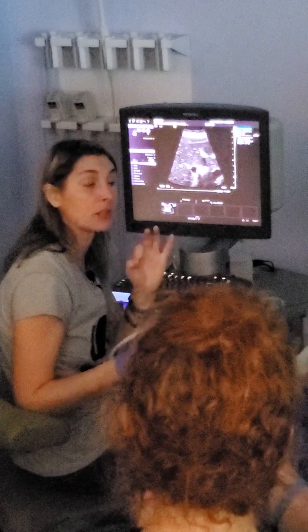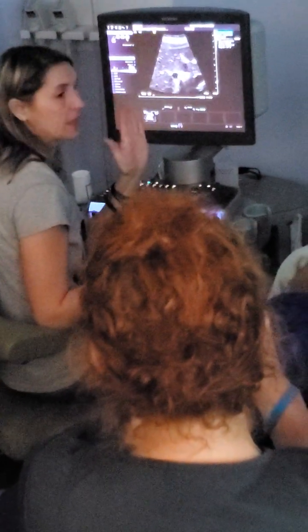Now these aren't necessarily round. We like to think of them as nice round structures like the aorta. They kind of take up whatever space is near them, like we saw that bowel is kind of compressing on the side of it, so it's got a little dent in it.